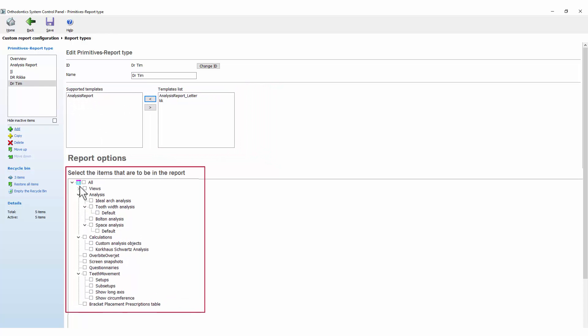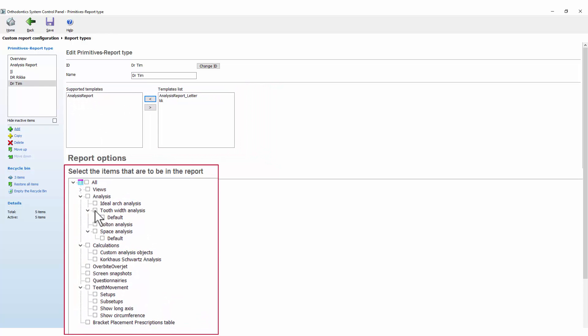Now you can select the different features you wish to be shown in this report type. Select All so that all of them will be enabled, or else you can choose specific ones.